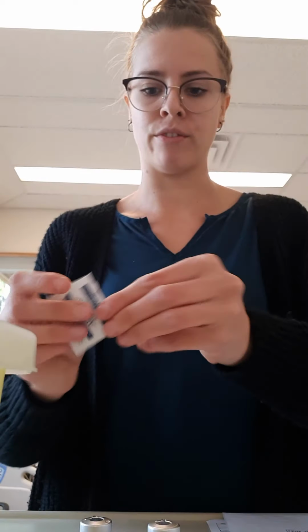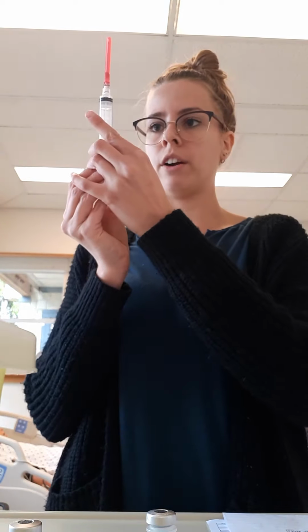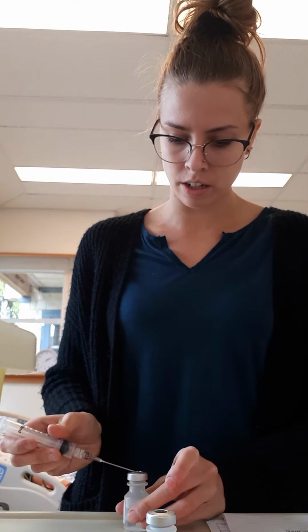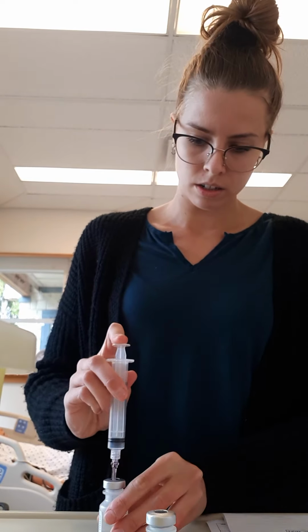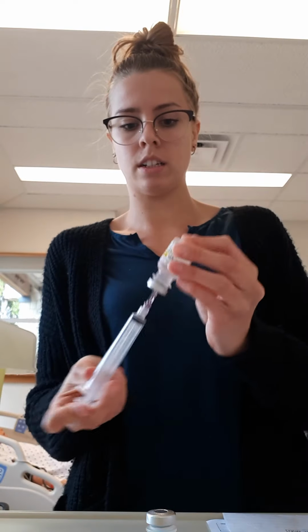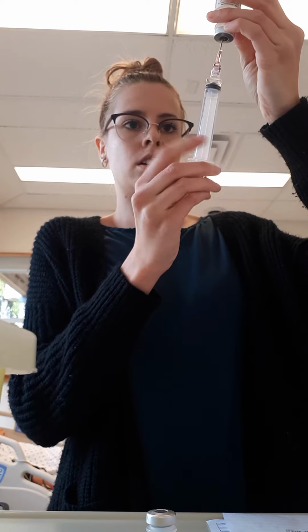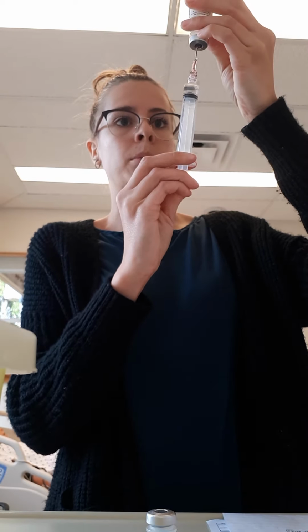So that's all good. Now I'm going to first swab the tops of my vials. We'll pretend that was for 30 seconds. I'm going to aspirate some air into my syringe and then inject that air into the normal saline. And then I'm going to aspirate 9 mL of my normal saline, watching for any air bubbles.